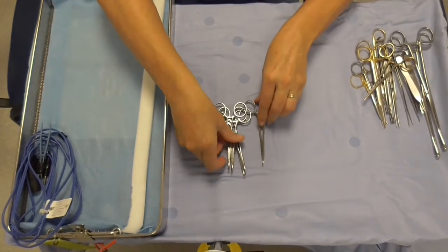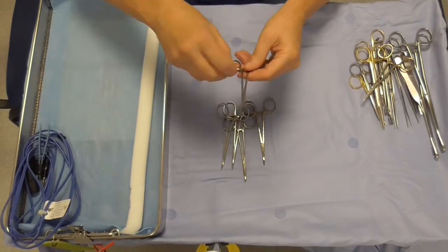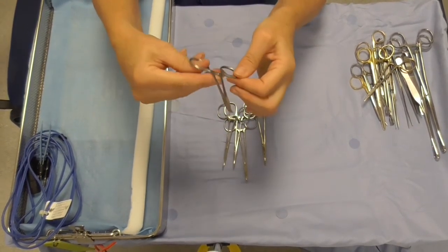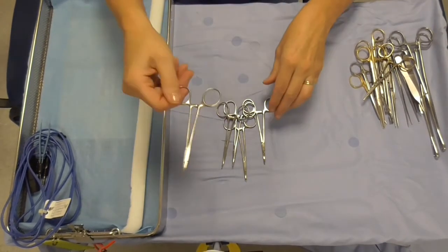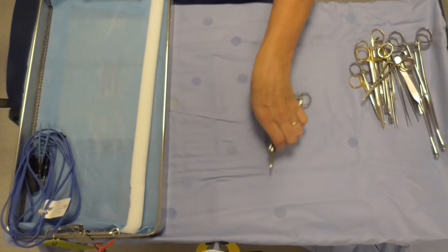Here we have some mosquito artery clips. You can see the artery clips have got that serration on the edges. These are mostly used for clipping of arteries or tying vessels, or some other uses that the surgeons may come up with — perhaps clipping drapes.